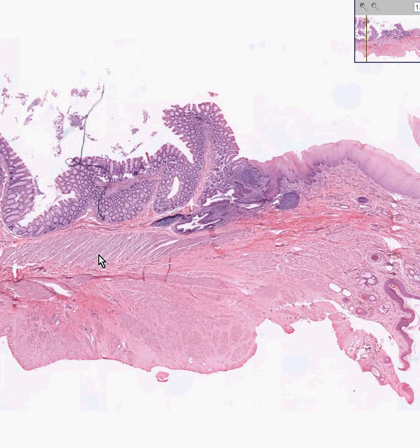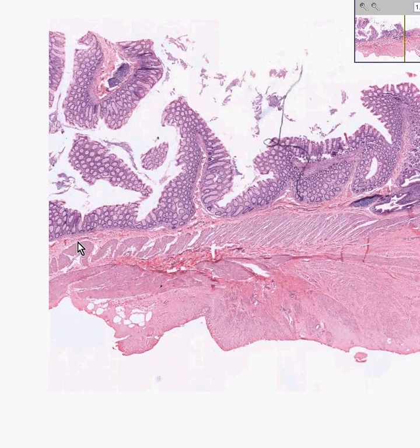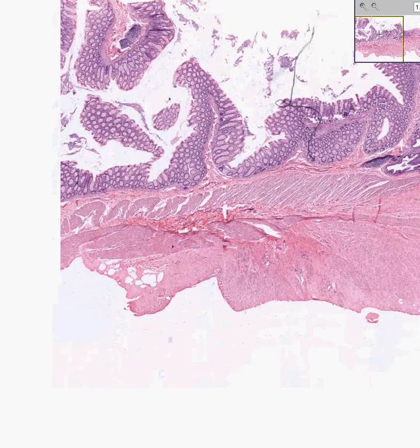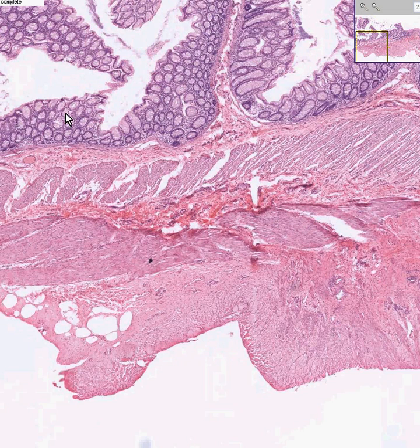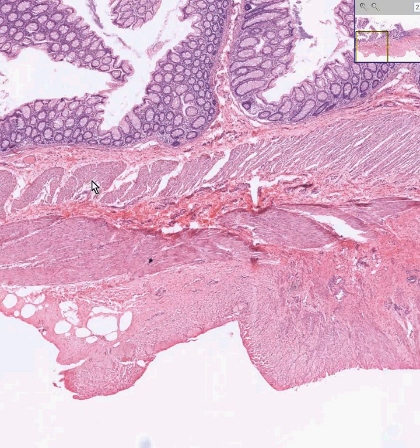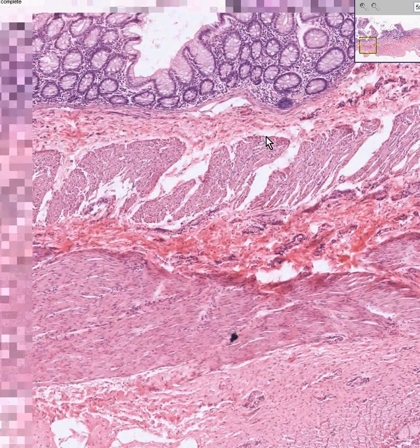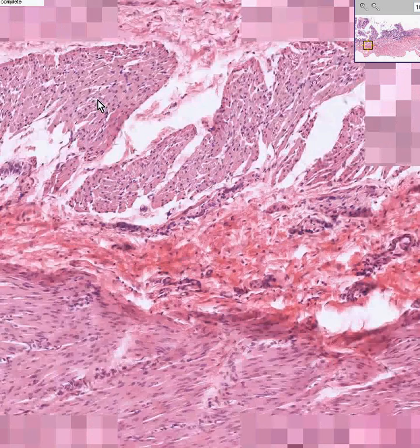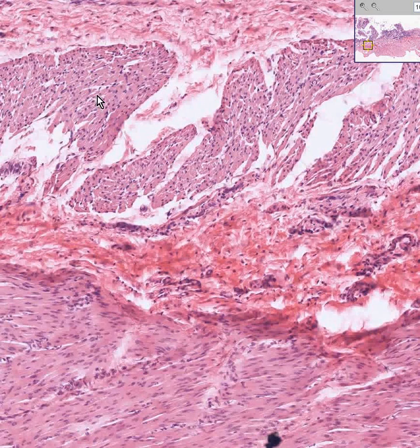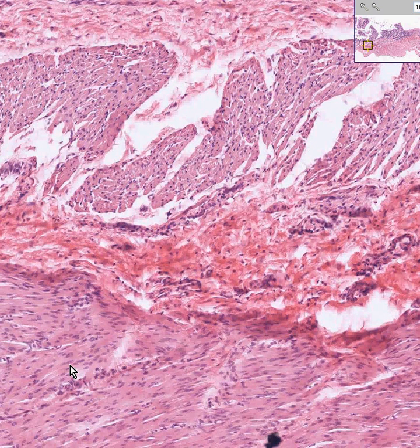Here is a rectum and an anus. Notice that in the lower part of the rectum you normally see an inner circular muscle layer as well as an outer longitudinal smooth muscle layer. You can verify this by the mucosa, a richly vascular submucosa, and then your muscle layers. The inner circular layer has nuclei cut transversely — they look round — while the outer longitudinal fibers cut longitudinally look spindly.